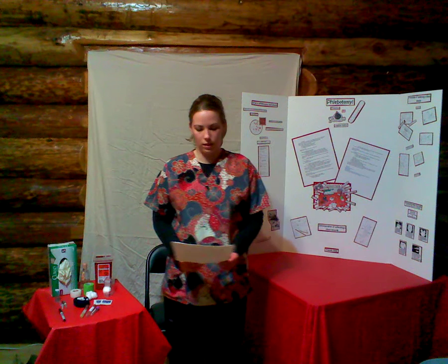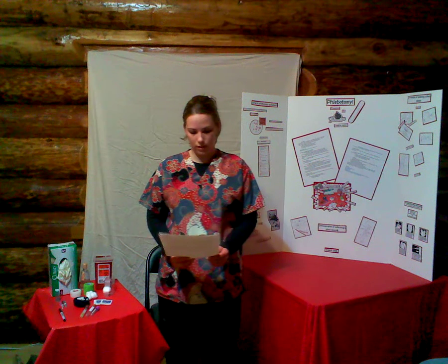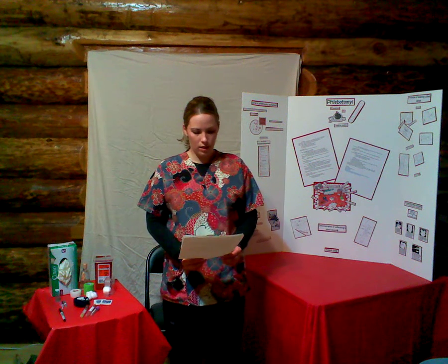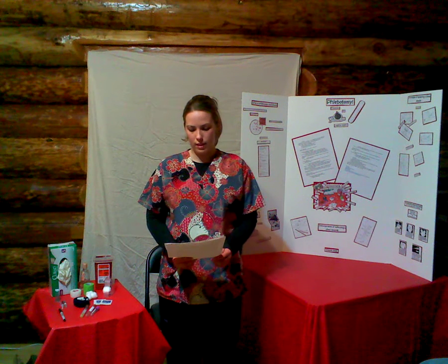Phlebotomy is the act or practice of opening a vein by incision or puncture to remove red blood cells from the body. Phlebotomy is also known as venipuncture.